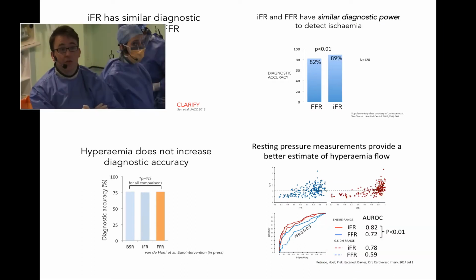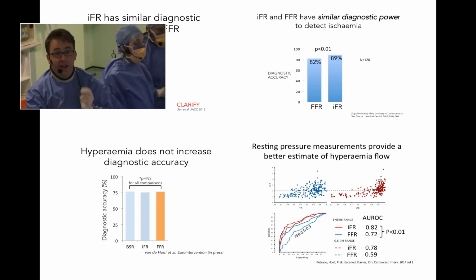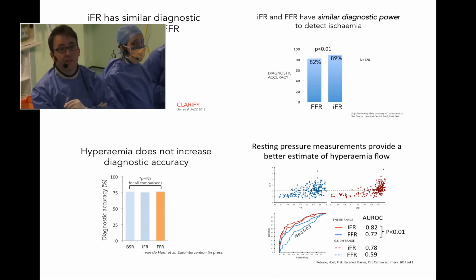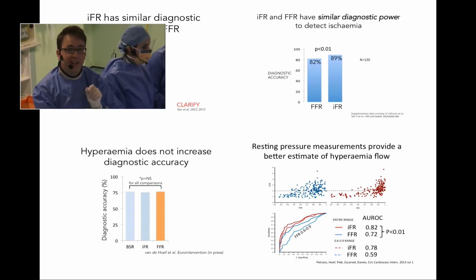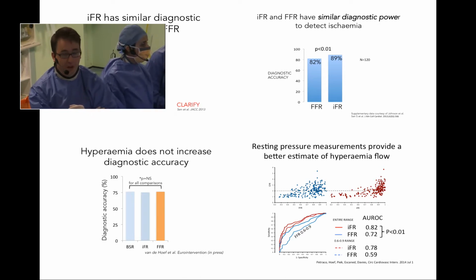The next study was a study which looks at comparing IFR and FFR to flow. And once again, you can see here, the same as Dr. Johnson found in Texas with HSR, that there's actually a slightly improved diagnostic accuracy with regards to identifying low flow or normal flow patients with the IFR over the FFR. And key in this study, really, it was the first study to show that potentially in the intermediate zone, the relationship between IFR and flow could be better than it is with FFR and flow. So this is an important study.